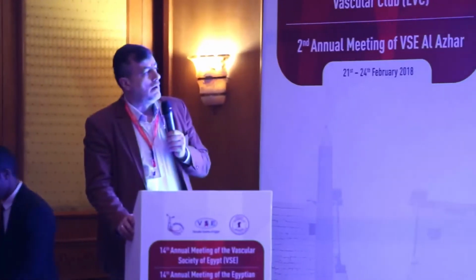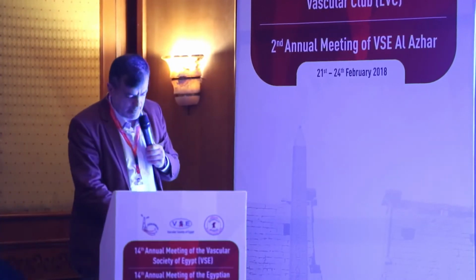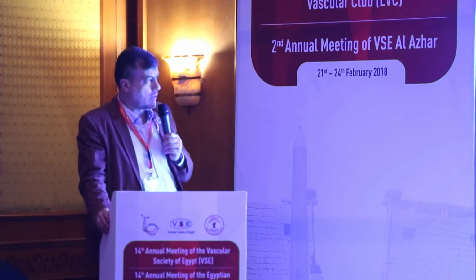The idea is you have to follow the secondary. It's the problem of the secondary tears in patients with TEVAR. That's the case of descending thoracic aortic aneurysm complicating a subacute aortic dissection with significant right common iliac artery secondary tear with a static malperfusion of the right kidney, with really an unexpected outcome.